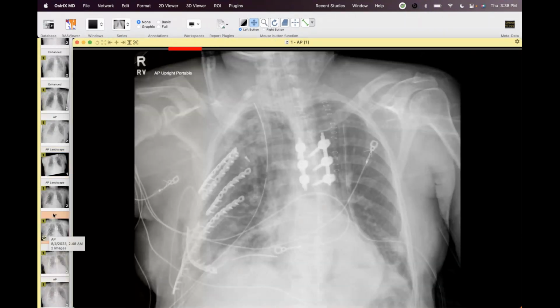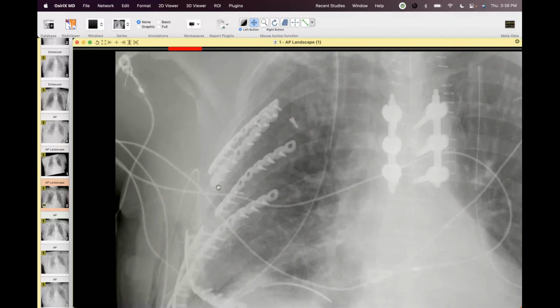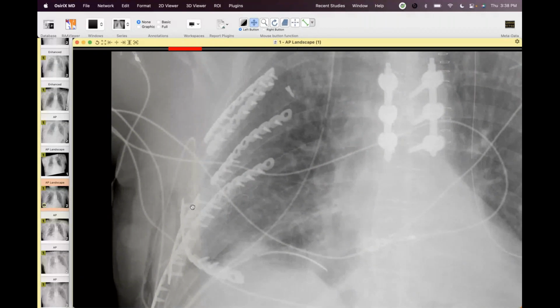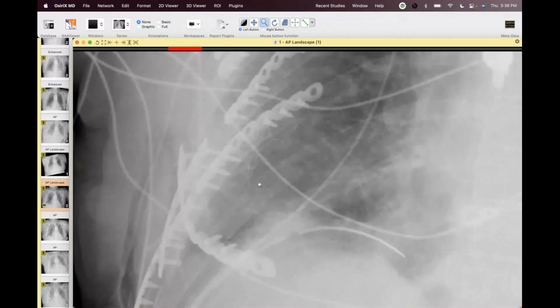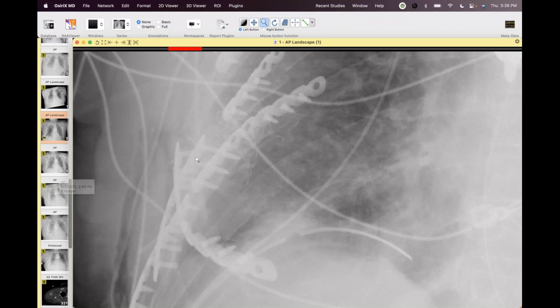So this is pre-rib fixation. This is immediately post-rib fixation. Now, this was an 8-hour plus surgery to fix these ribs. And you can see there is one screw loose here that they were aware of. But the other finding, and I will tell you, it was not seen on this radiograph, but do you guys see as I zoom in here, a little bit of wavy something there? Yeah, I can see that now. It doesn't look like a retained sponge. It's not very dense, but there's something there.